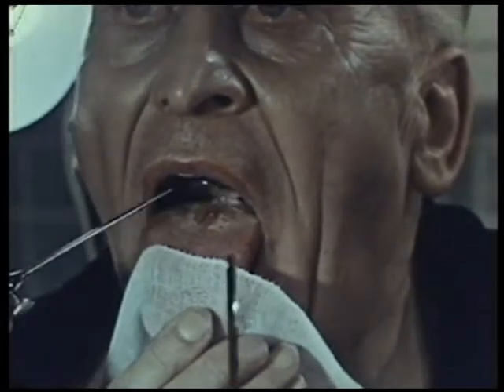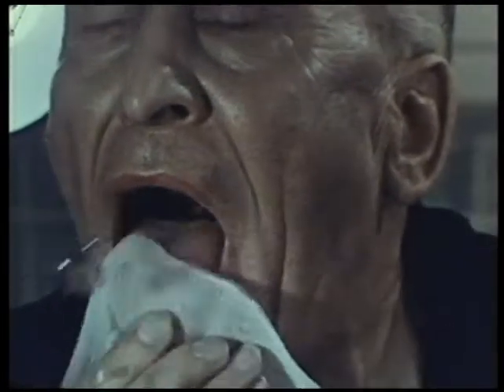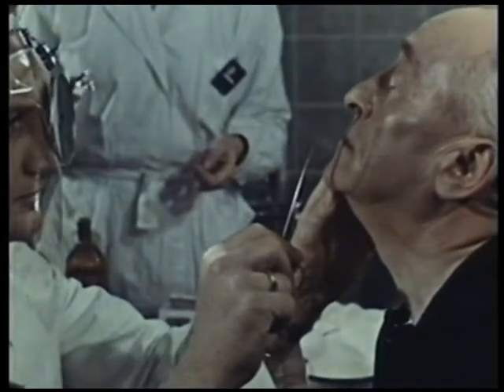Then, with the aid of a laryngeal mirror, the trachea and bifurcation are anesthetized. One side of the nasal cavity is then anesthetized for the passage of a catheter.